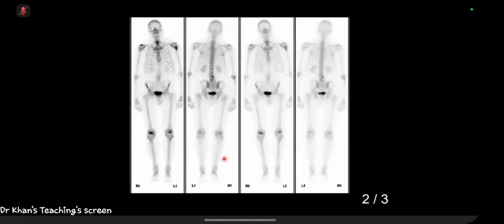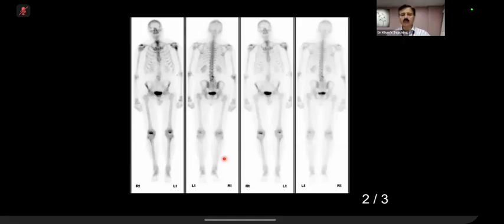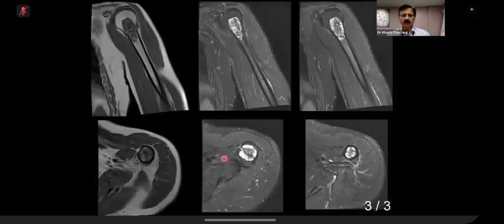I'm not sure that the presence of uptake is particularly helpful because the underlying benign lesion might well take up tracer. Excellent. So that's the key, and this has come in the viva also. Please remember that up to 30 to 35% of enchondromas can show uptake on nuclear scan. This is not taken as a sign of malignant transformation. Indirectly, nuclear scan doesn't have the specificity.